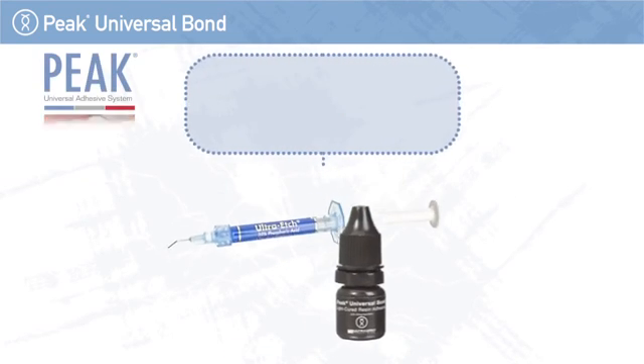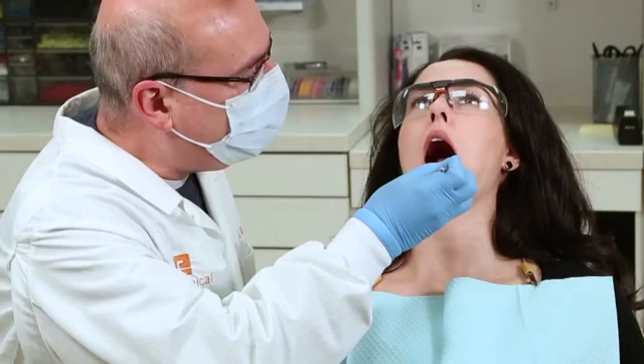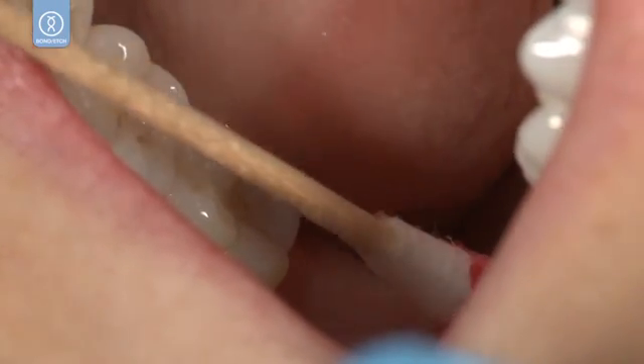Class 1 Restoration using Ultradent Ultra Etch and Peak Universal Bond. Place UltraCare Topical Anesthetic.